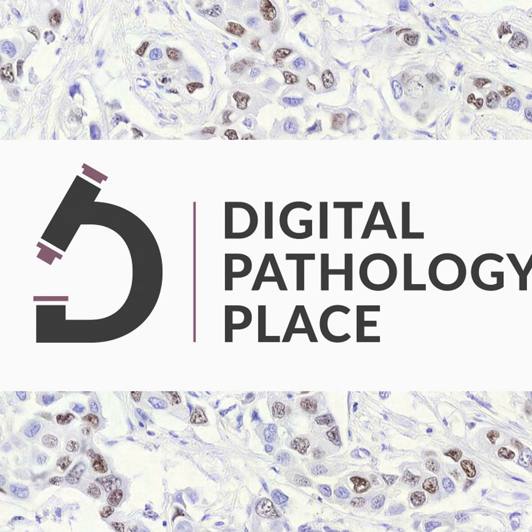So you guys are the hub that everybody else connects to. Cytomine will be the platform that will be launched when you ask to see a data set. So for example, you want to develop an AI, and you get connected to the repository. You see that within this repository there is a data set of images that may be interesting for your research. You ask the consortium, can I have access to the data set? And if they say okay, they will deploy a Cytomine just for you, and within the Cytomine you will have access to these images, and you will be able to annotate them, plug your AI to them, and make your training and your inference, whatever you need.